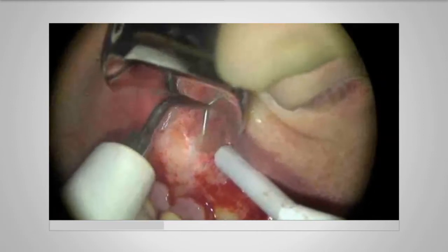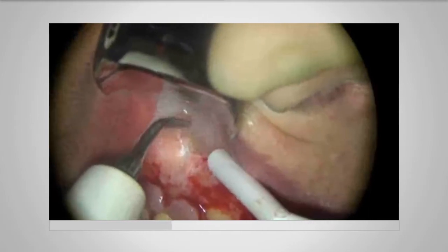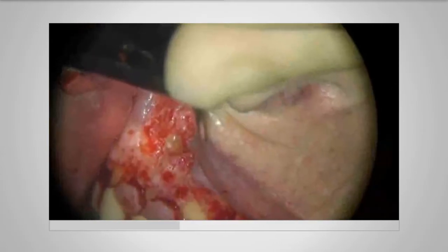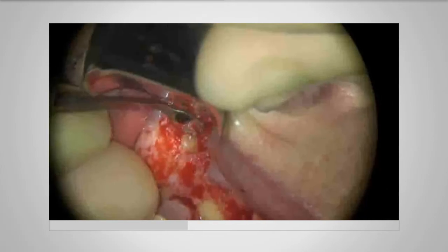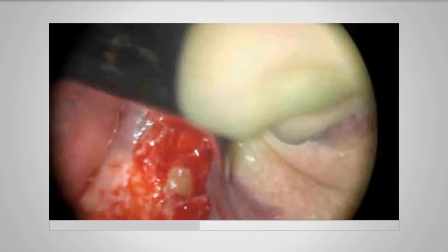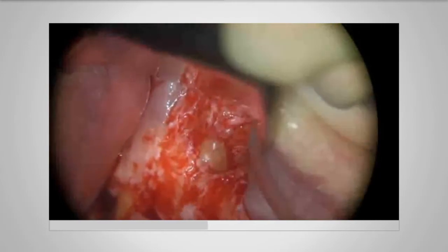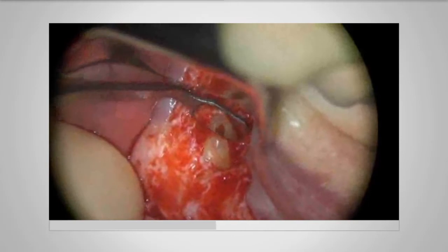so I've gone back in with my 7 millimeter long ultrasonic tip. And again, checking with the micro mirror, I'm looking down there and I can see right down the prepared root canal. High power. And you can see the tip of the post there at the bottom of the root end preparation.